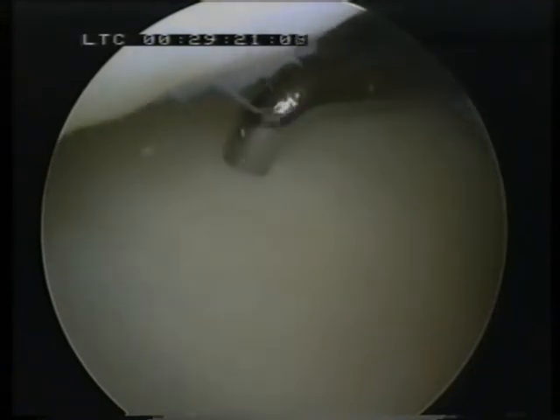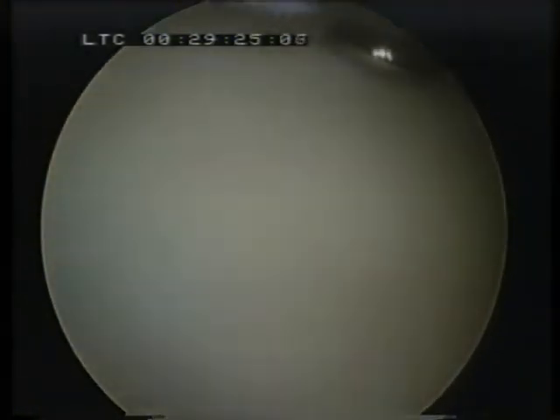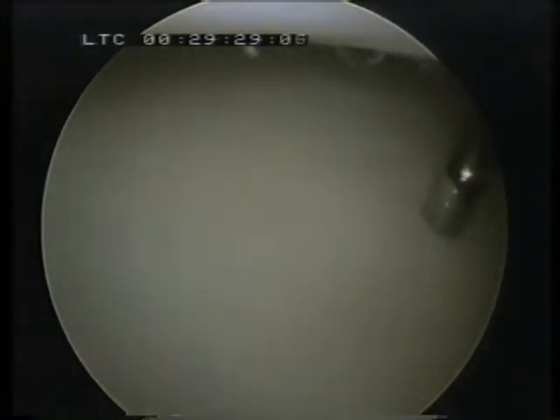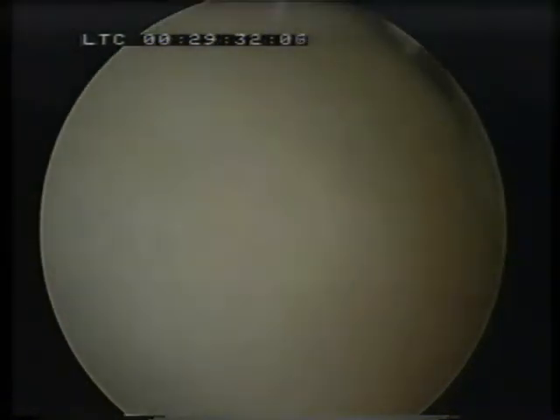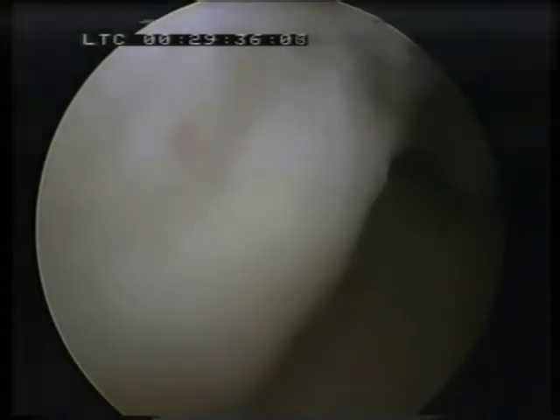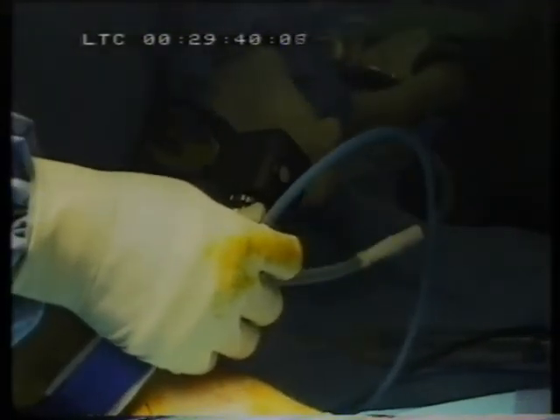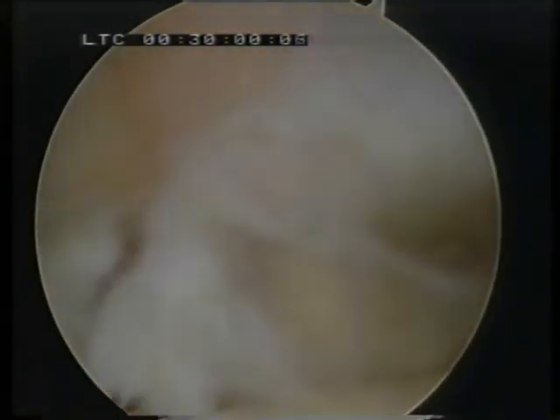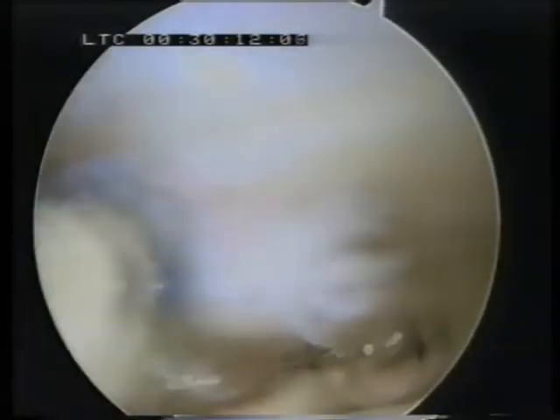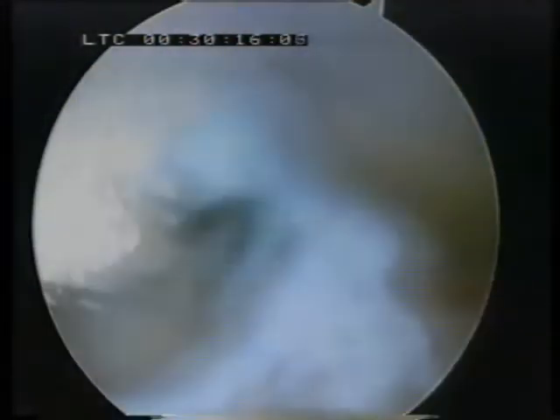Looking down on the tibial surface, you can see that the tibial surface does pit there to a minor degree — some areas more than others, as you'd expect with early arthritic development on the ankle. Now I'm going to change the portals over and look at the medial side. When you look at the medial side, you can see that he has a minor degree of synovitis associated with his arthritis. Once again we pass in the chondrotome and simply remove this material.